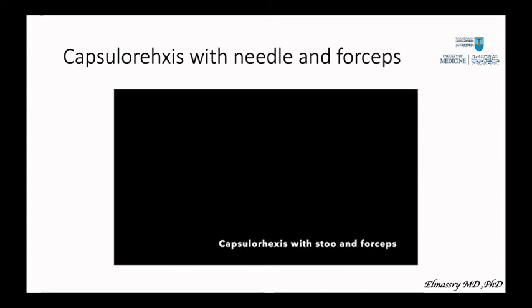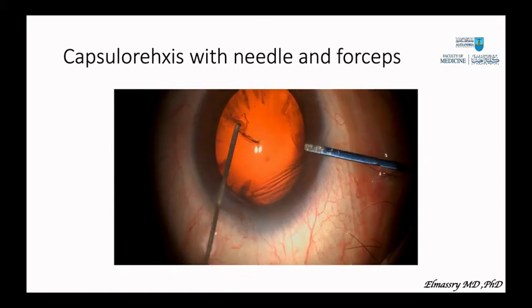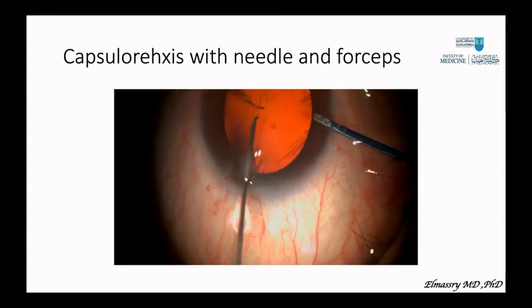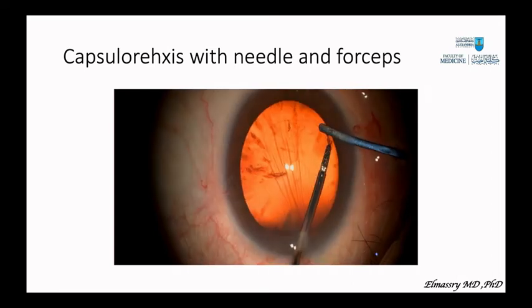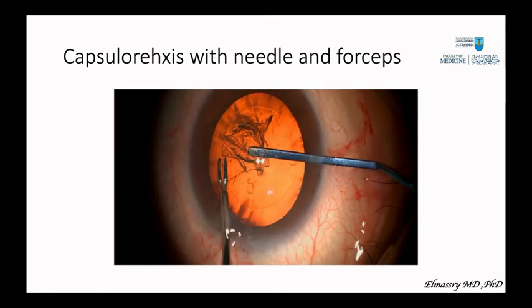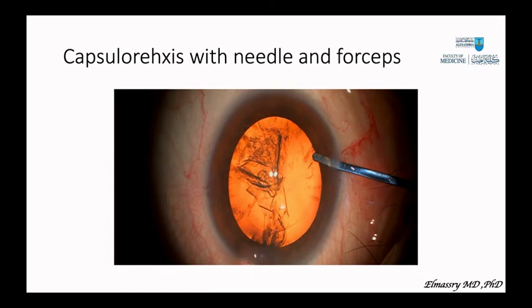Sometimes you start with the SA2 or with the insulin needle, but you feel that the rhexis is starting to be far away, or you are not controlling, or it is a very friable rhexis with multiple edges. Here, in order to have a good rhexis, it is preferable to go out and have the capsular rhexis forceps, which is more controllable and easier to follow, and to do your capsular rhexis as usual in a circular manner. And this, as we said before, the spatula in the second hand helps completing the rhexis. If you have a radial tear, you have to change the direction to centripetal direction.